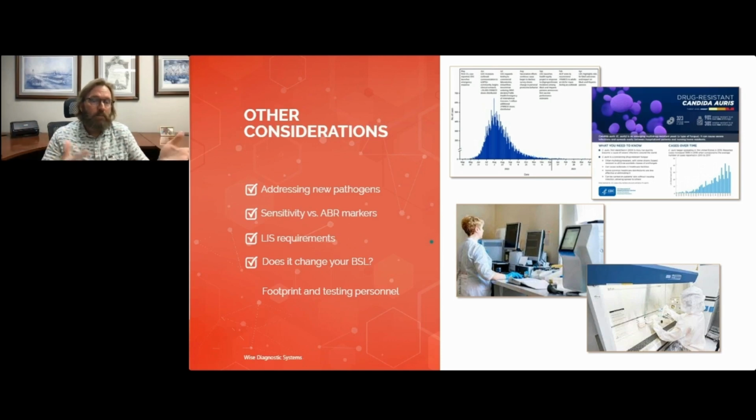Otherwise, you can't get in the validation material that you need to actually go through the clinical side of the validation. And then the last, as I mentioned before, is just the space available and the testing personnel.